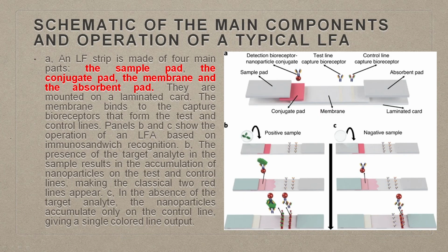When we talk about immunoassays in general, the logic is pretty straightforward. You have, say, a toxin, and against that toxin you raised antibodies or any kind of marker.